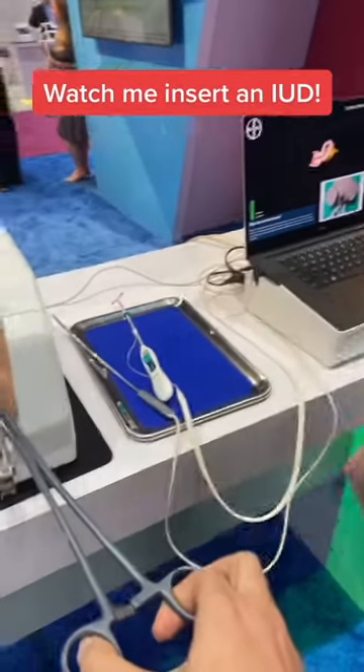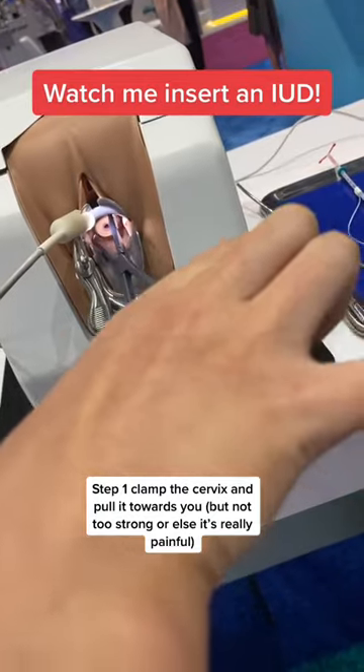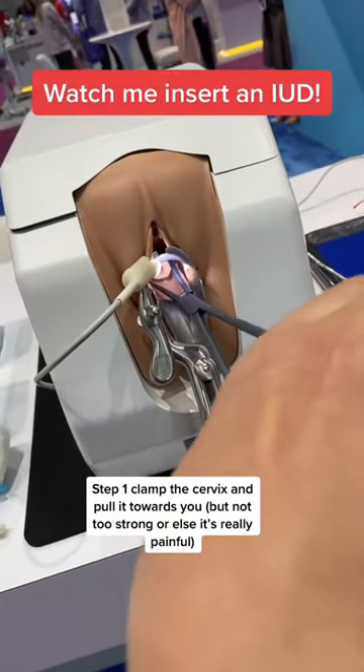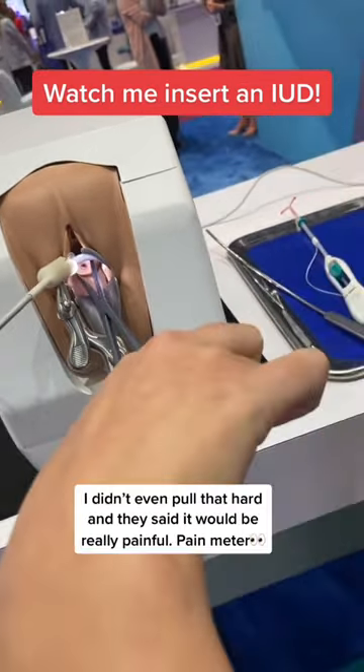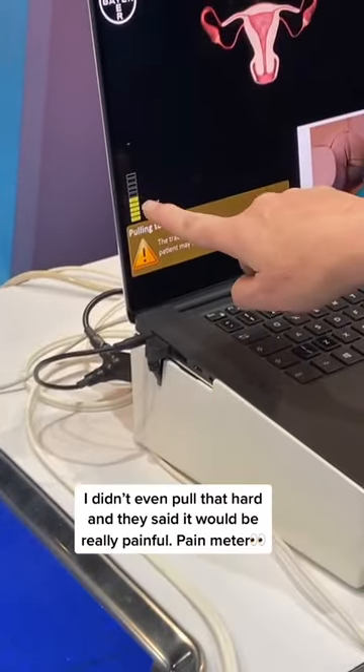This is how an IUD is inserted. Step 1: clamp the cervix and pull it towards you, but not too strong or else it's really painful. I didn't even pull that hard and they said it would be really painful.